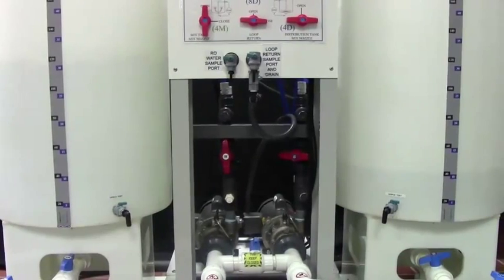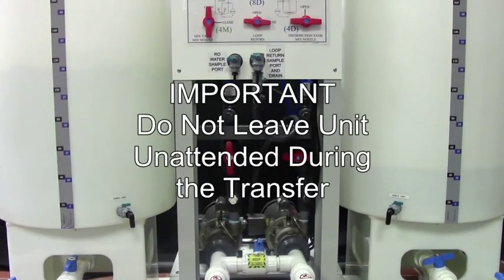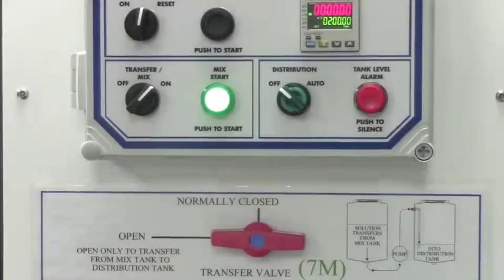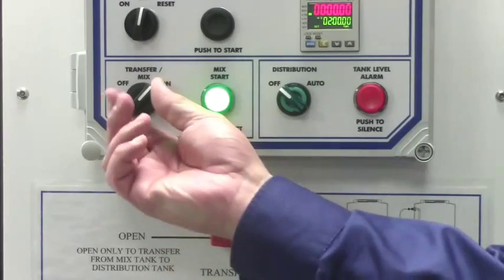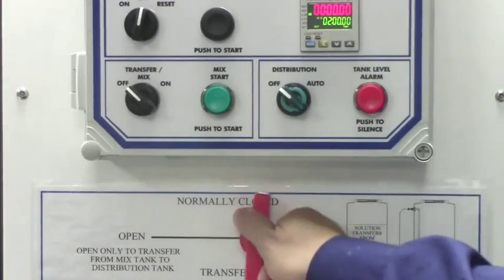The water will begin to transfer to the other tank. Do not leave the unit unattended during the transfer. Allowing the system to run when the tank is empty will damage the pump. When the transfer is complete, turn the transfer mix switch off and close valve 7M.